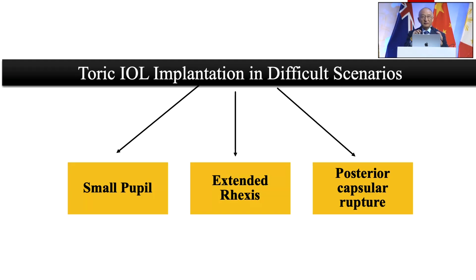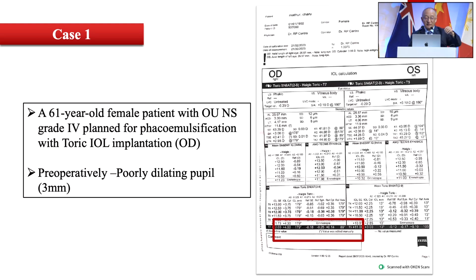Ramamurthy. I thought I'll show one or two videos because our dear friend Dr. Maligan could not come this time. So I'll show you one video on small pupil, how to manage these cases also. So this was one case.